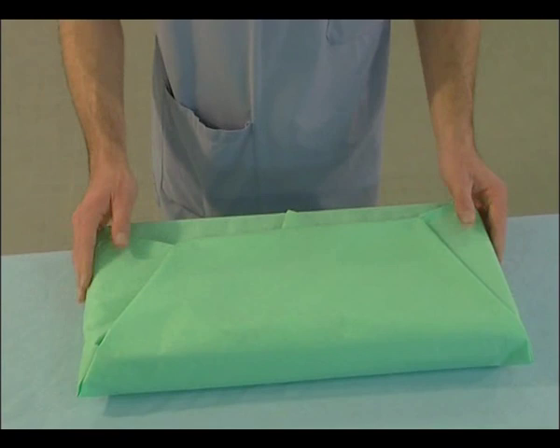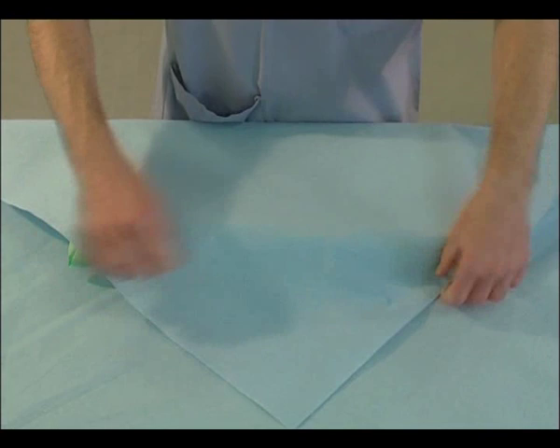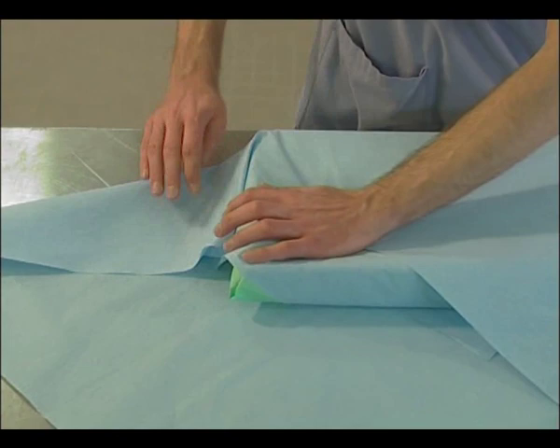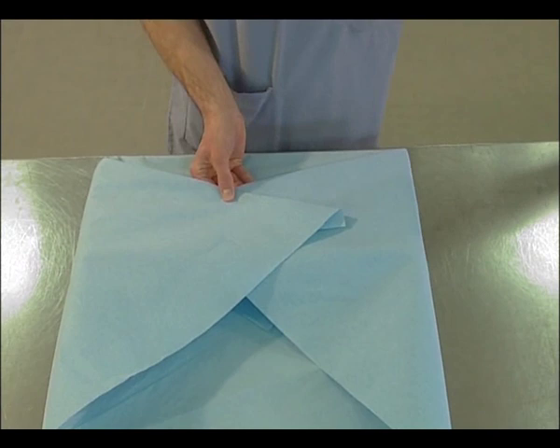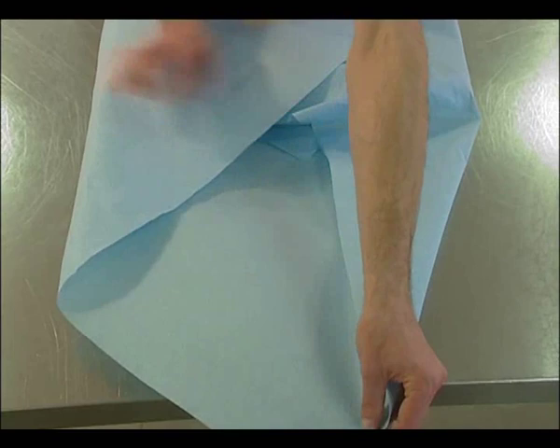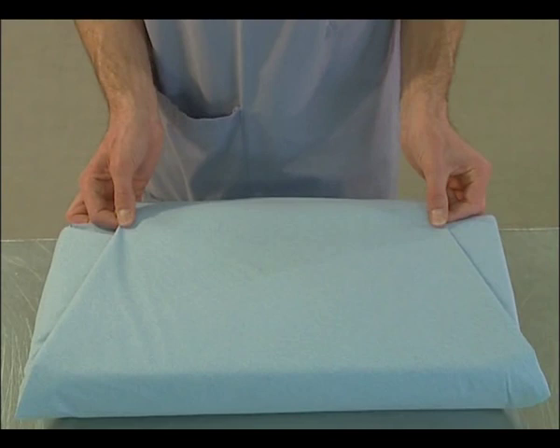Folding the two wraps separately, one after the other, imposes a more tortuous path. Therefore, this double fold method affords a two-step aseptic unwrapping process for users in the operating theater. Opening a pack wrapped using the envelope method will be easy and requires less handling thanks to the release tab.